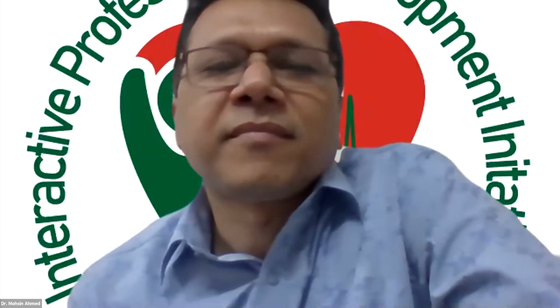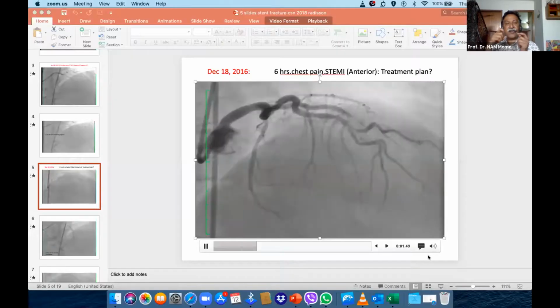Actually, stent fracture can happen in two ways. One is acute stent fracture, when it happens during the procedure. The other is in the old patient, post stent.